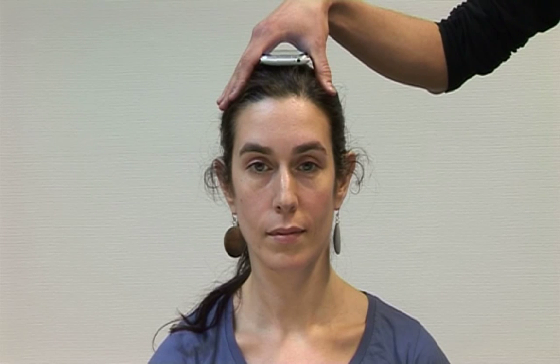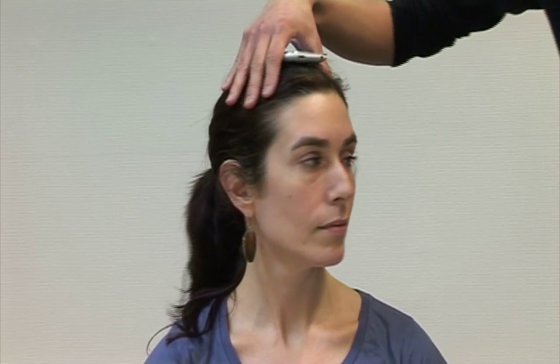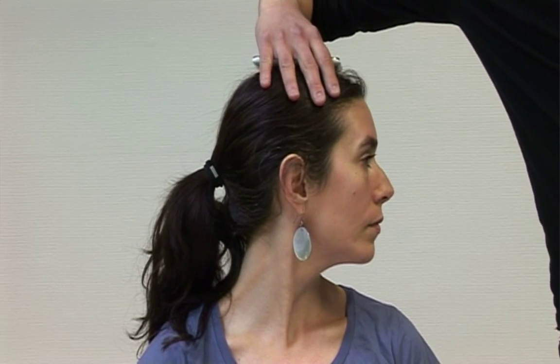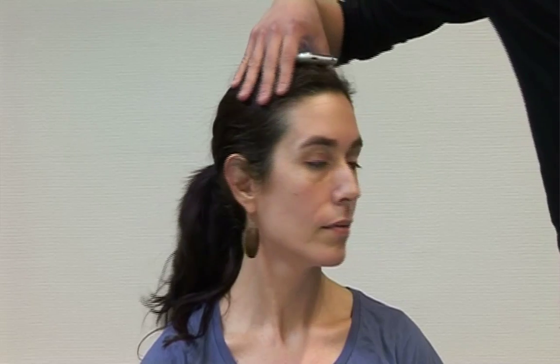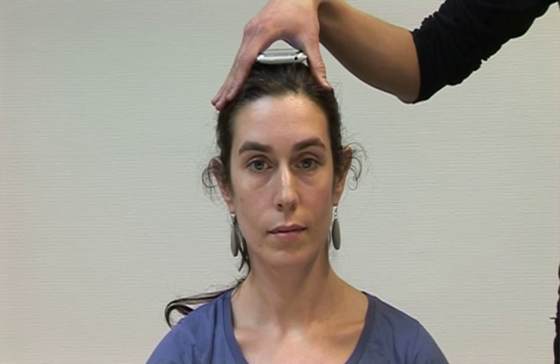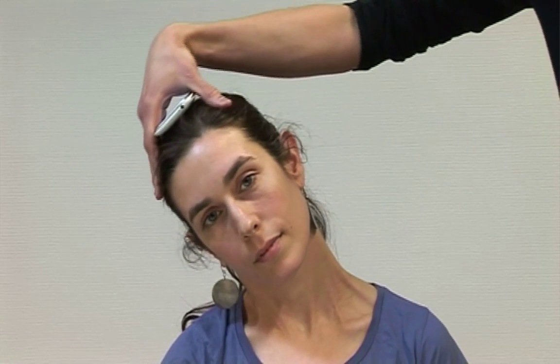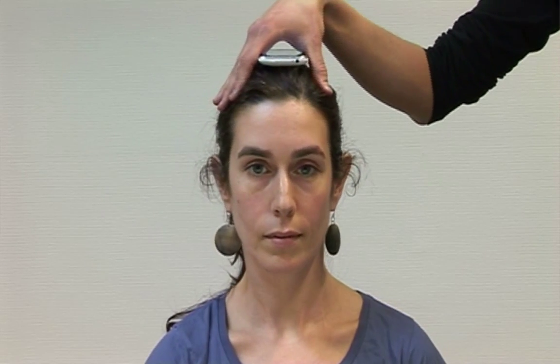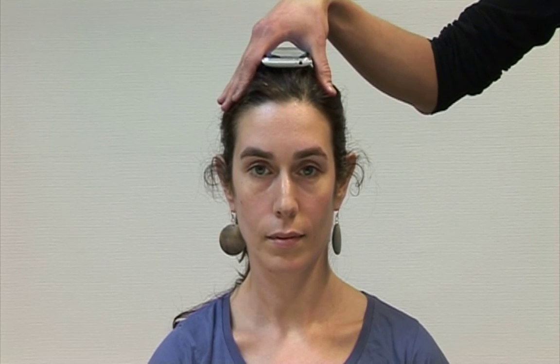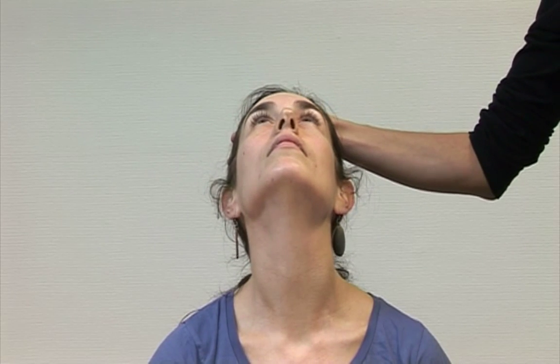Look straight ahead. Look left. Look right. Look straight ahead. Left ear to left shoulder. Right ear to right shoulder. Look straight ahead. Look down. Look up. Your test is completed.